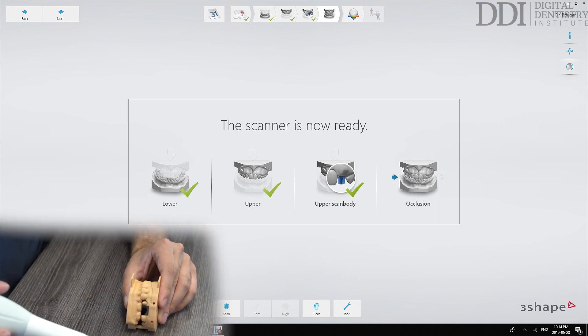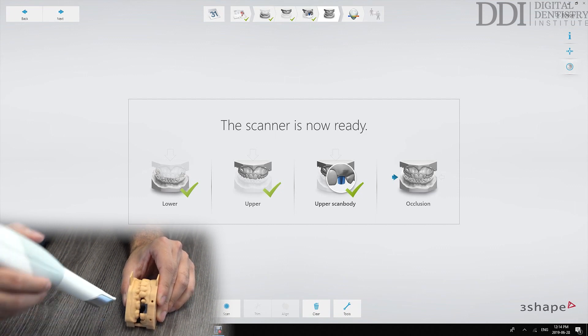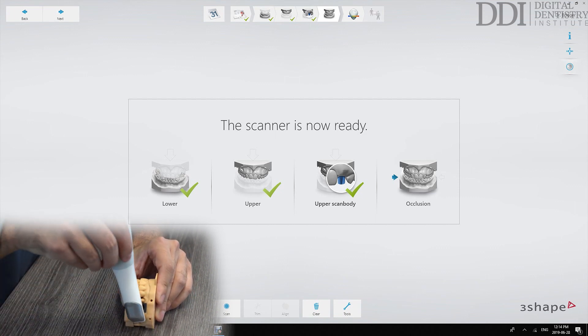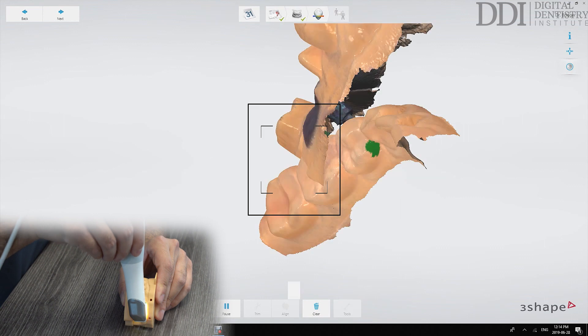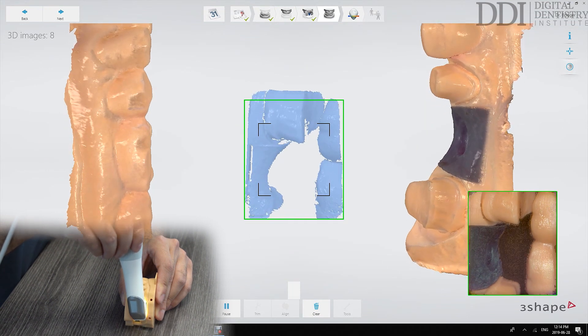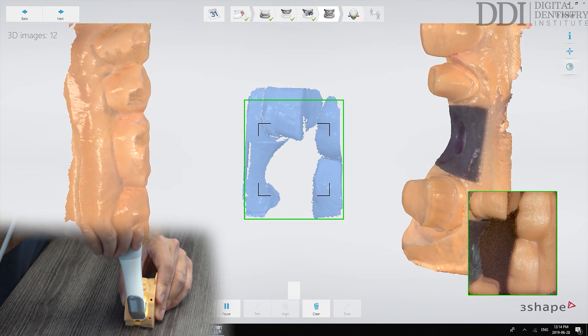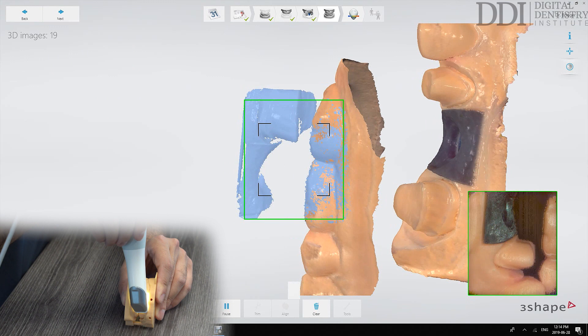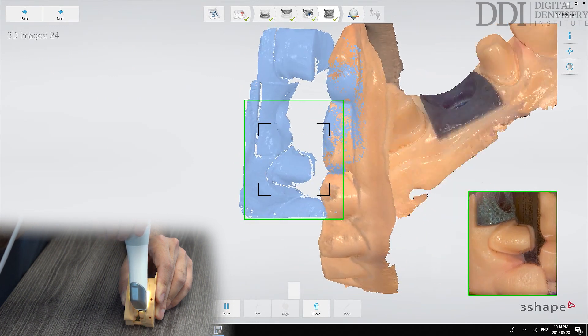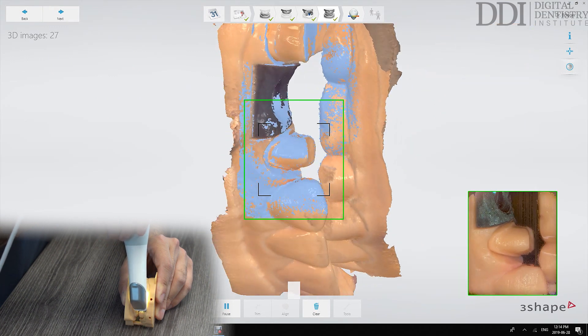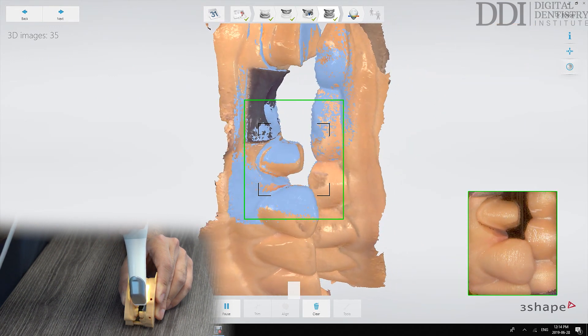So once the patient is in that accurate jaw relationship position we'll take a buccal bite scan. What we're looking for is to capture enough of both the upper and the lower dentition to allow the software to merge both of those files into the correct occlusal relationship.